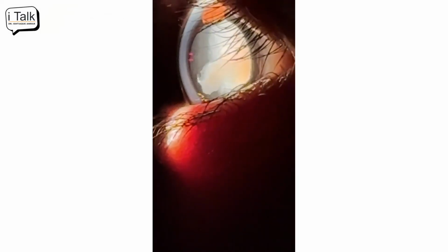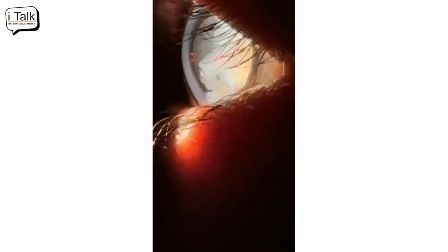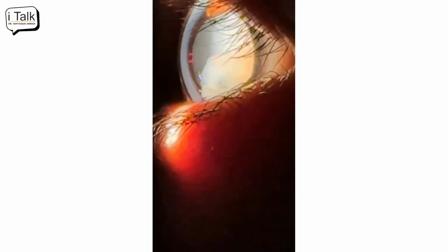Okay. So now I'm going to show another video. So do you do this? There is some good literature that suggests that you do a YAG cap before you take the patient. Any experience or thoughts on this?